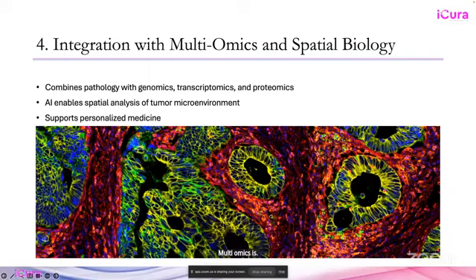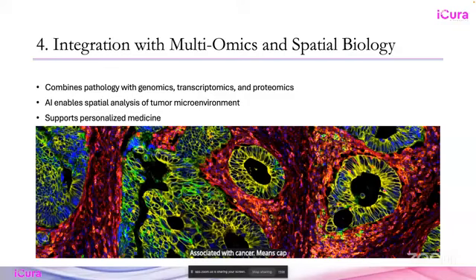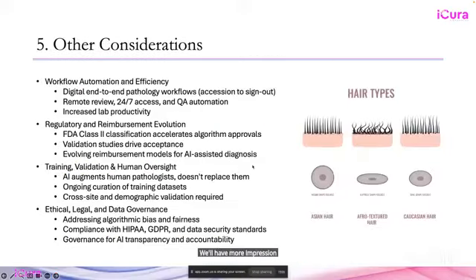Multi-omics is something we also strongly believe in. The image you're seeing here is a multiplex immunofluorescence where the yellow is the pan-CK showing the invasive colorectal cancer, and the green is a certain marker that makes them different. Then you start to see the red, orange, and everything. Those are the immune cells. Some of them are cancer-associated fibroblasts, CAFs. Some others are regular fibroblasts. These are all hot topics, especially in extracellular matrix modulating agents or drugs research, or immune checkpoint blockers, or immune modulating drug development. I believe the audience who are in this field will have more impression on this particular presentation.